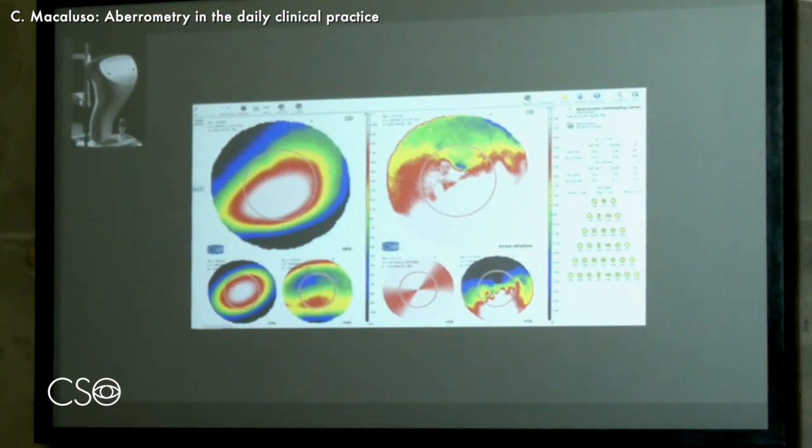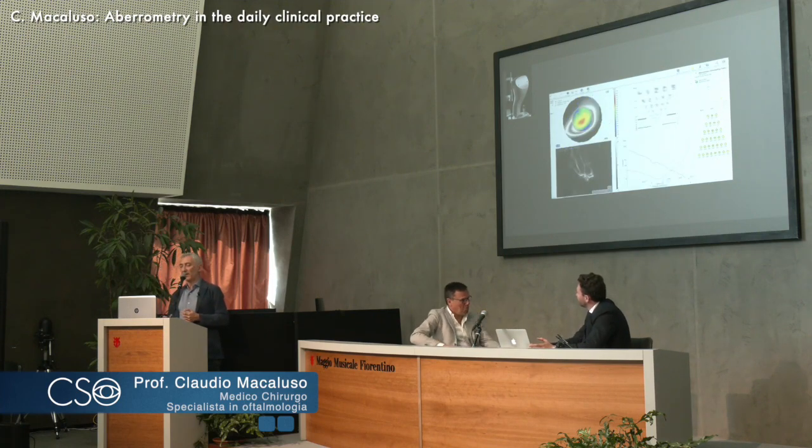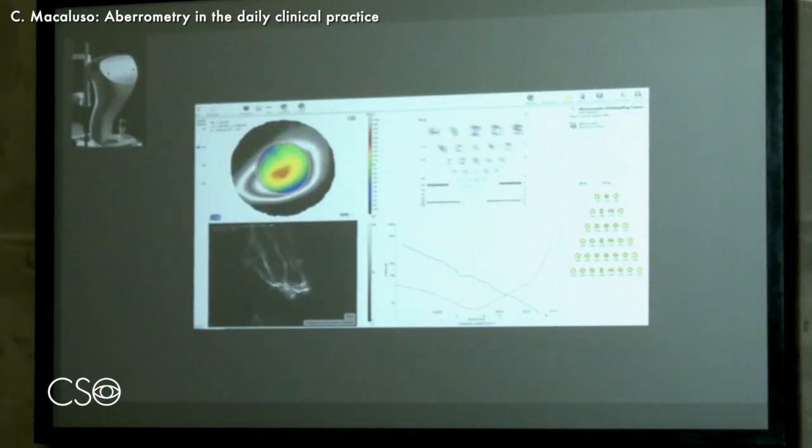This is an eye with keratoconus, advanced keratoconus. You see on the left lower panel, also the high order aberrations are pretty high. The coma is pretty apparent there. This vertical split in two parts, typical of keratoconus. And the optical effects of this, of course, are major. This is the PSF with a 3 millimeter pupil. It's just terrible. The larger letters are barely visible.